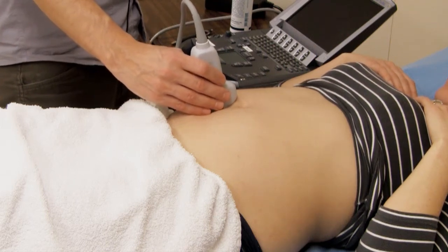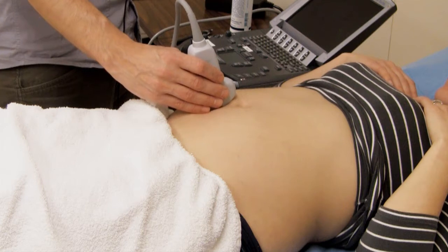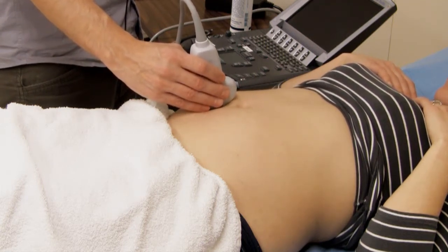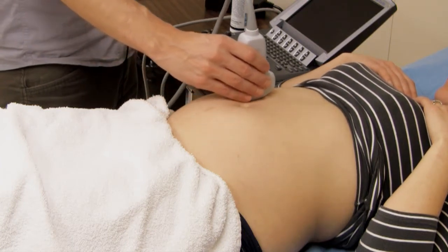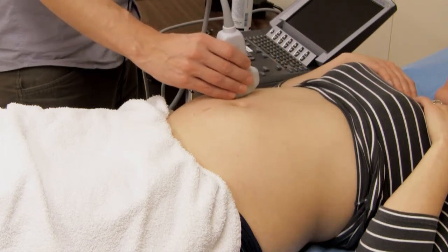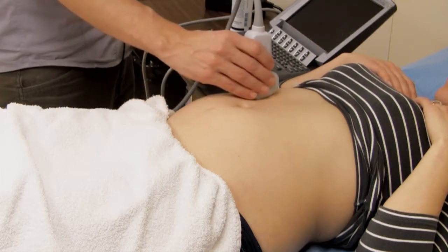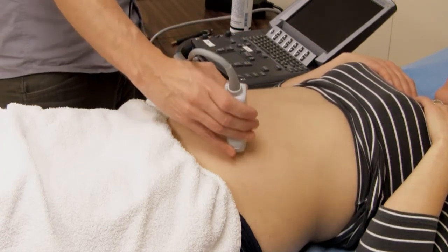This video introduces the probe movements you'll be using during your POCUS scan. The most common probe movement is the slide. In sliding, the probe remains upright and its orientation in either longitudinal or transverse is maintained. The probe is then slid along the skin so the contact area between the probe and the skin is constantly changing. The probe will thus move along the body in longitudinal or across the body in transverse.